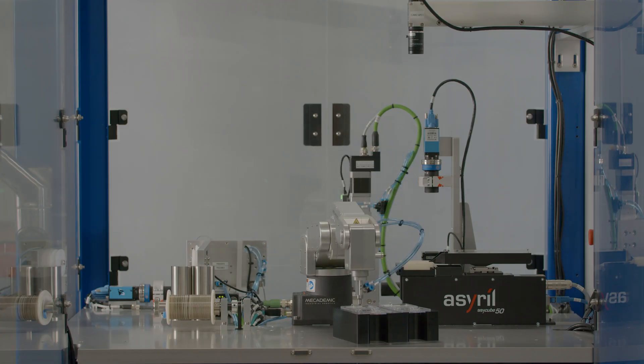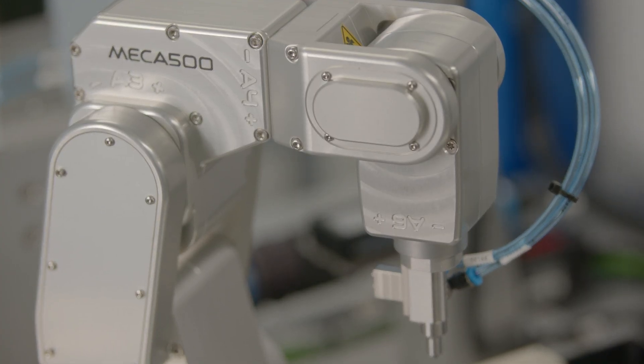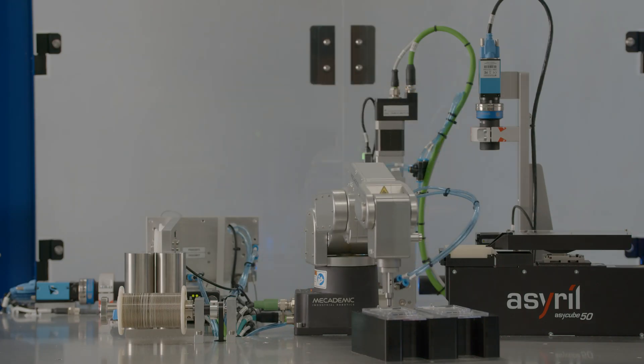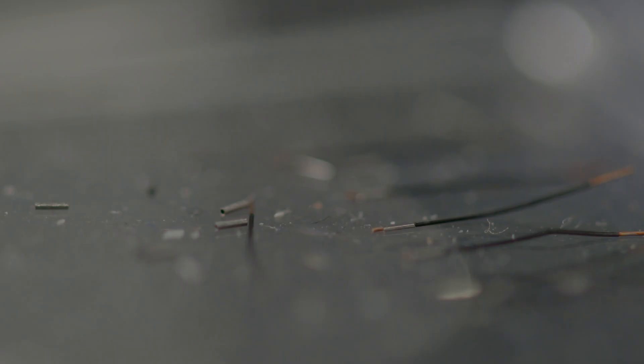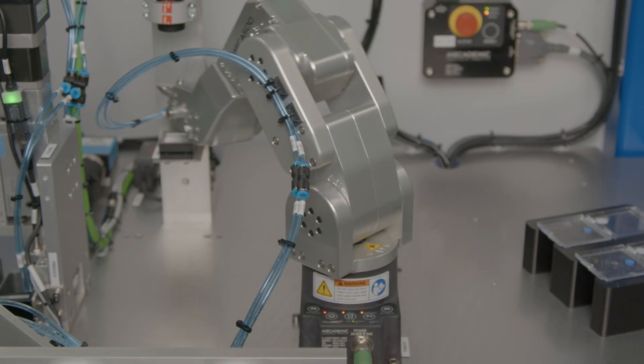We're right on the edge of some of the latest and greatest technology. That Mecca 500 robot is one of the smallest six-axis, most precise robots. It's down around sub two microns in position.